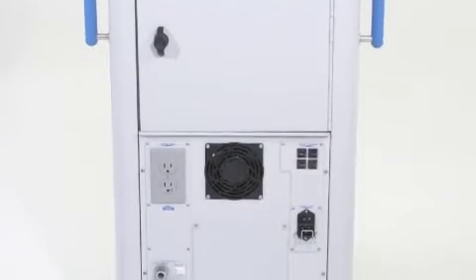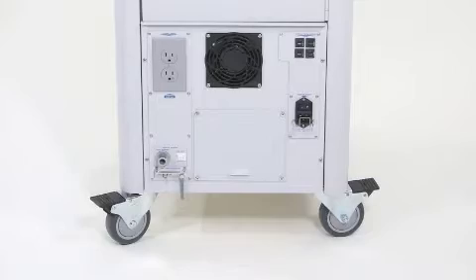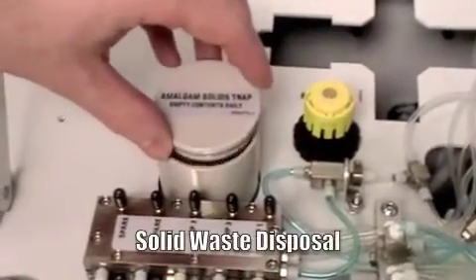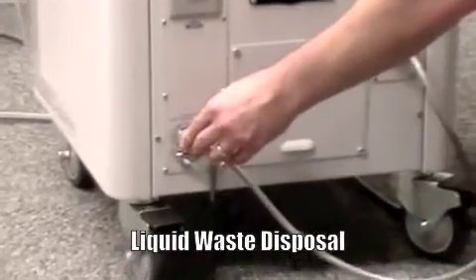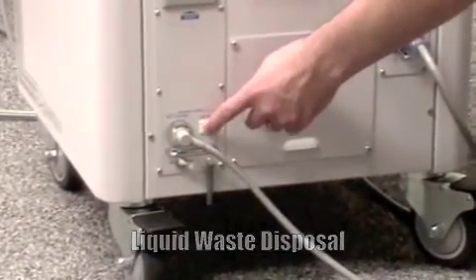There's a second outlet for any countertop consoles on the rear of the unit, as well as many other important features. Simply twist the handle to open and access the waste container storage area. Solid waste is filtered through a disposable screen trap located under the main lid. Replacement screen traps are available. Attach the supplied hose to the port and activate the pump to remove liquid waste to an approved receptacle.